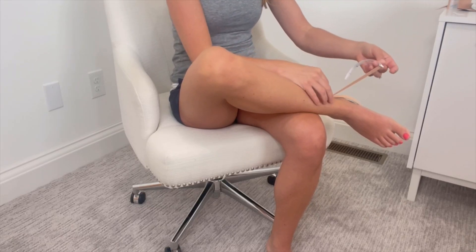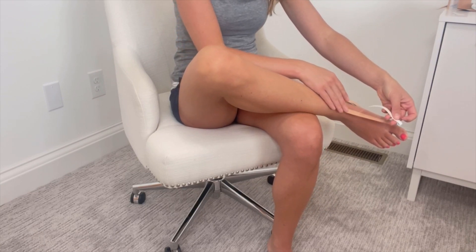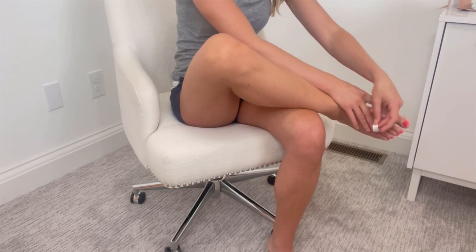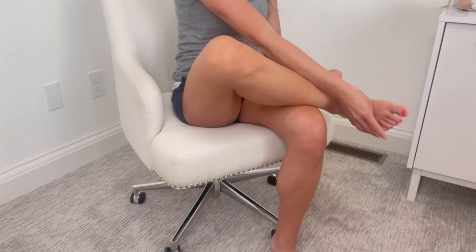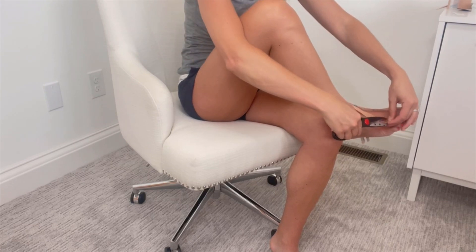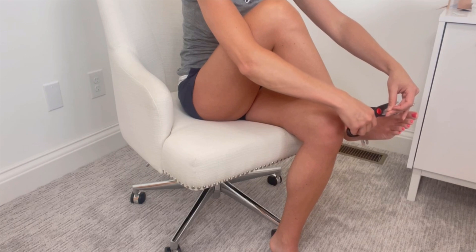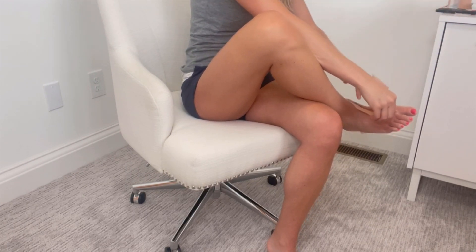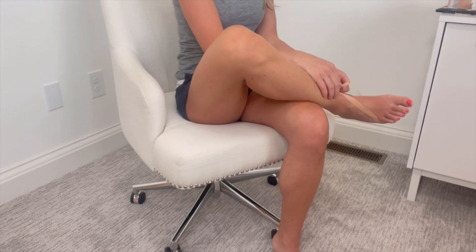From there, we're going to peel back each strip one at a time. We want just a little bit of tension on the tape — not pulling as hard as we can, just a little bit. We go over wherever the swelling is, over the foot, to the end. That last little bit — about an inch — we don't want tension on that; we're going to just lay it flat. If it's a little long, trim it back so it doesn't go past the toe. Then the same thing with the next strips — a little tension, no tension at the last inch, lay it flat and smooth it out.